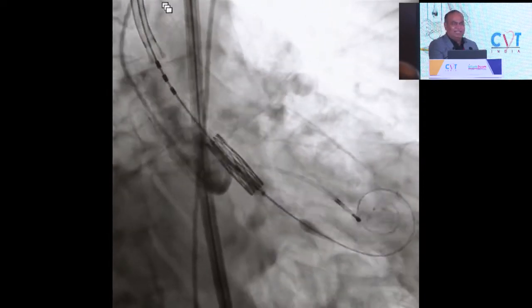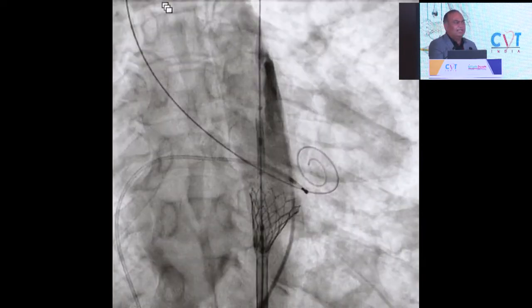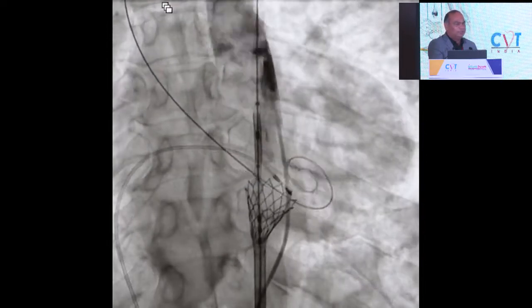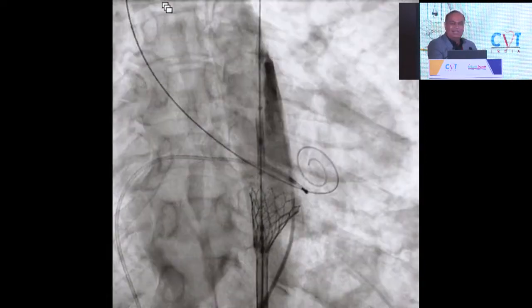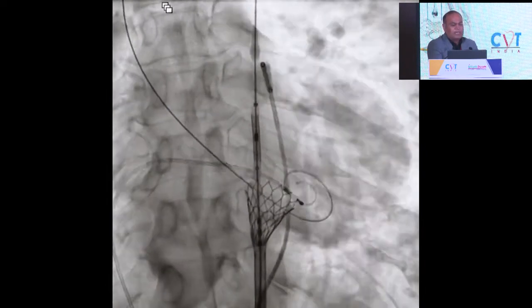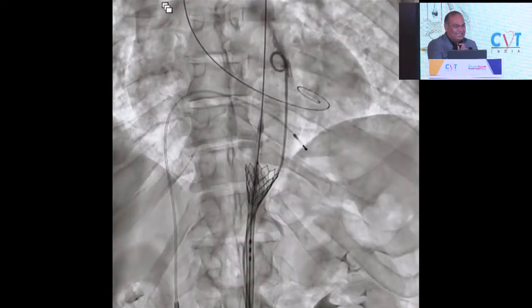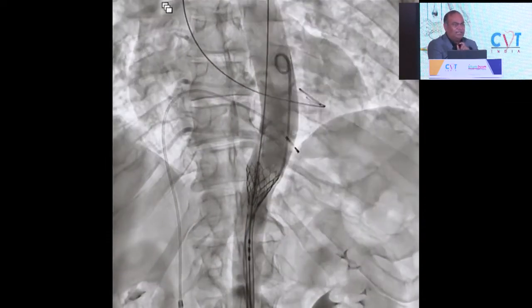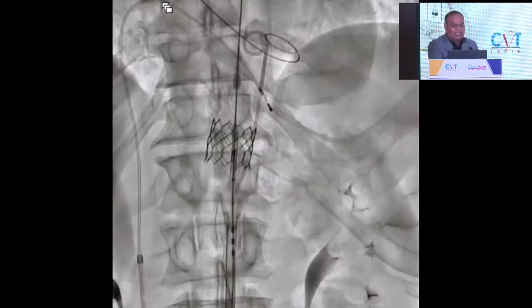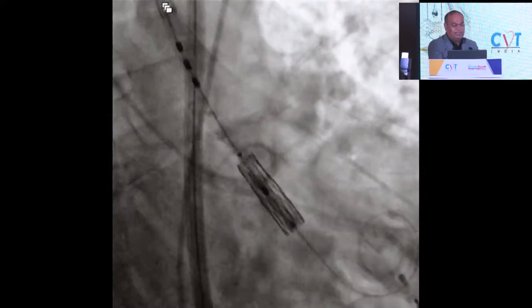Not a big deal. Every day you'll deploy this and nothing will happen, except in this case where the aortic side of the valve did not open. Just the ventricular side opened, hence it popped up in the aorta, we brought it down in the descending aorta and deployed. So pay attention to that. Are the markers at the edges of the stent frame or not? Take an extra minute to deploy it. In this case, we just went ahead and deployed a second valve.